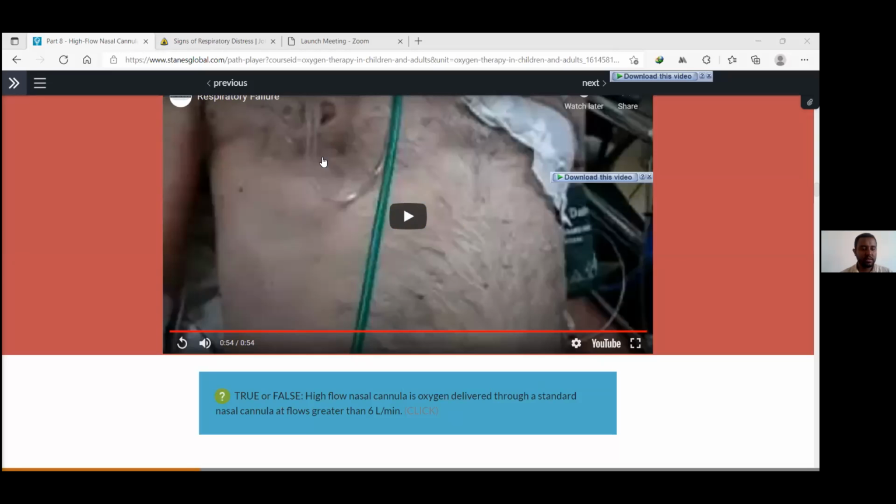Maybe the ones who said false, can you just briefly justify? So in the polls, still 74% true and 26% false. As he said, it needs a humidifier. Okay. Yes, actually it needs a humidifier, but can you elaborate more on the flow?